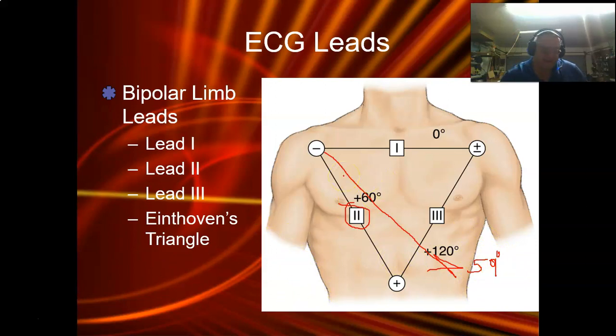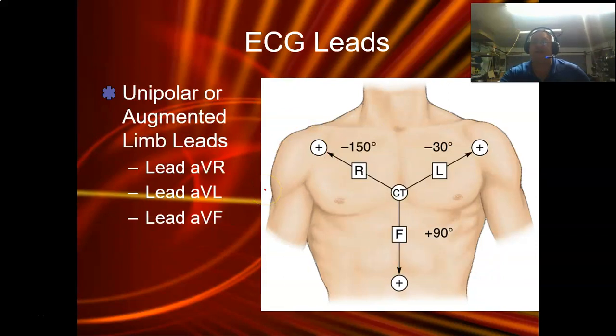Now, with that being said, I will also tell you that it's great for telling arrhythmias, but there's one arrhythmia in particular that's actually probably a bad thing. But the good news is you guys are actually pretty good at reading it at this point. By the way, your augmented leads, these are the angles that it takes to see the augmented leads, which is why, most of the time, we don't look at this guy, okay?